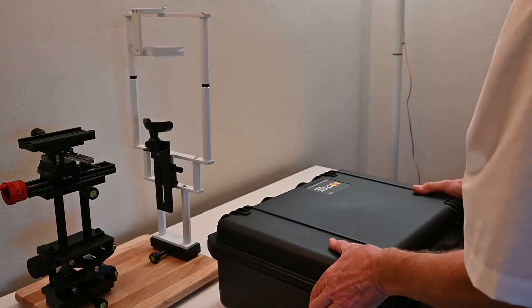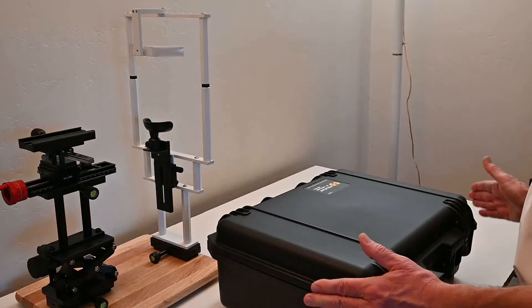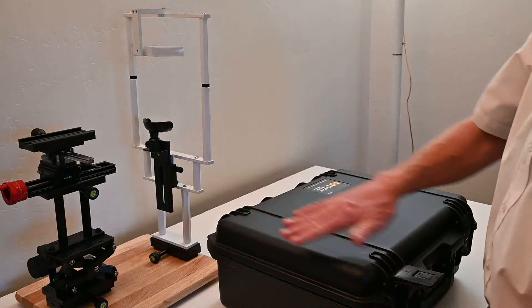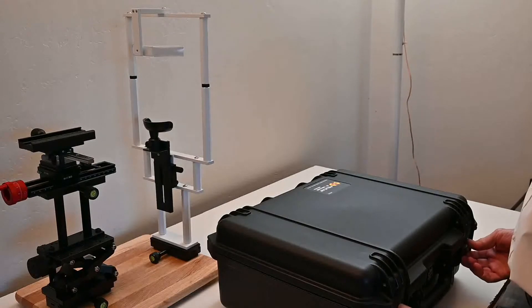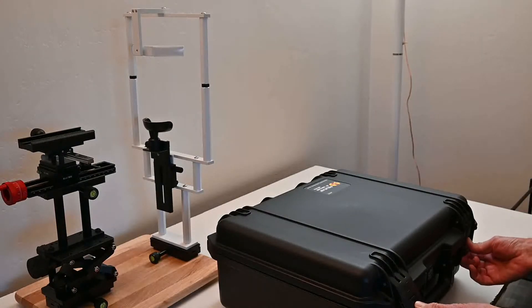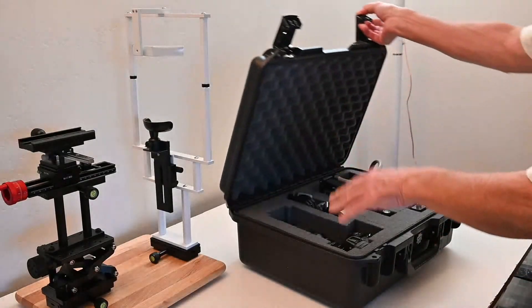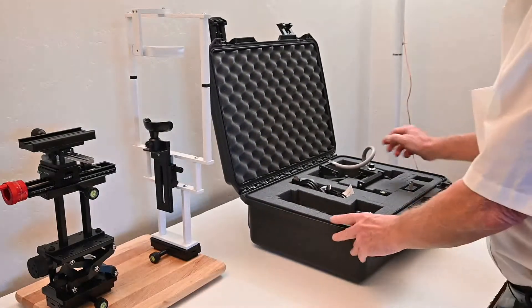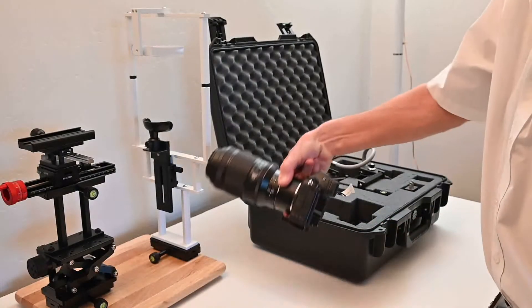The camera comes in a carry case that is 20 inches by 16 inches by 8 inches. Open it by pushing in the center button and then lifting the latch. After opening, the first step is to take the camera out and set it down.